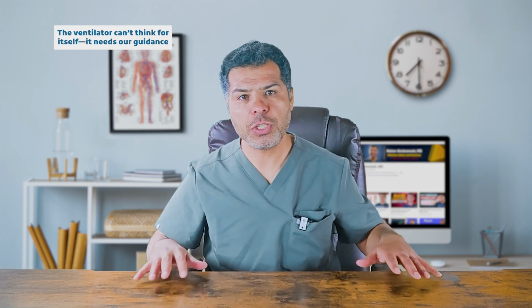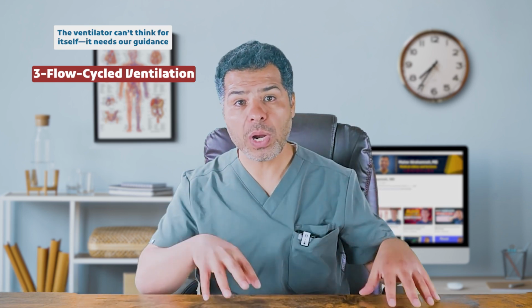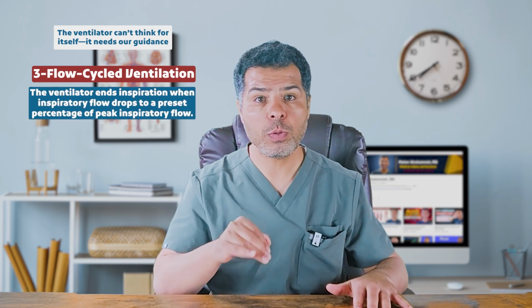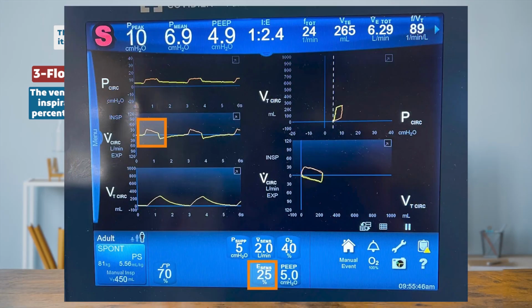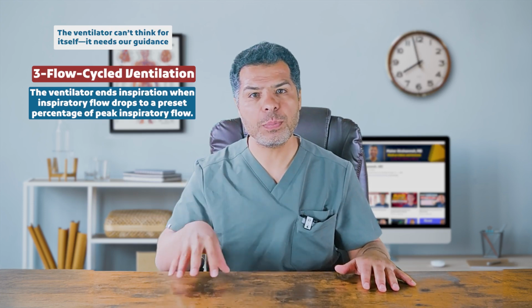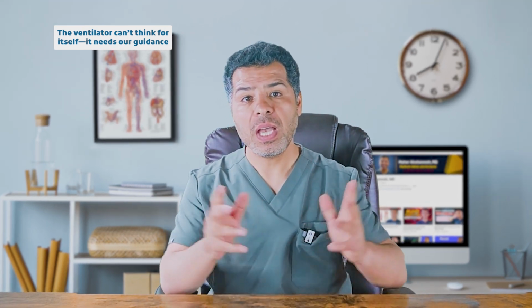Let's move to the third way the ventilator cycles from inspiration to expiration: flow cycle ventilation. In flow cycle breath, which is used primarily in pressure support mode, we'll come to that later, the ventilator ends inspiration when the inspiratory flow drops to a preset percentage of peak inspiratory flow. Look at the screen and see the E-sense, or expiratory sensitivity, setting, commonly set at 25%. The breath ends when the flow falls to 25% of its peak during inspiration. What do you think will happen to the tidal volume if we set E-sense at 50% instead of 25%? It will be smaller, as we have a shorter inspiratory time, and the opposite is true.